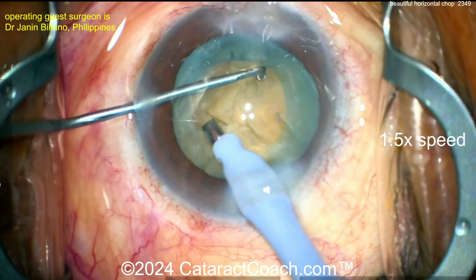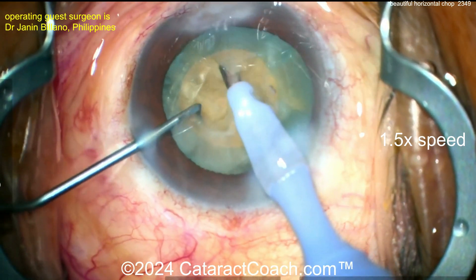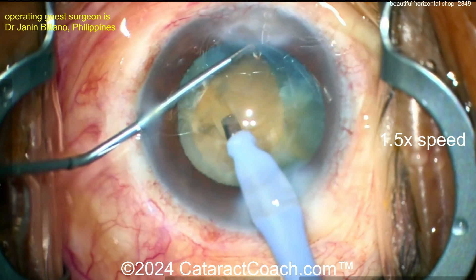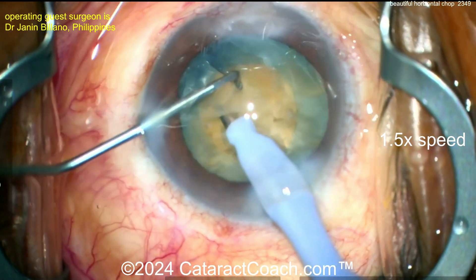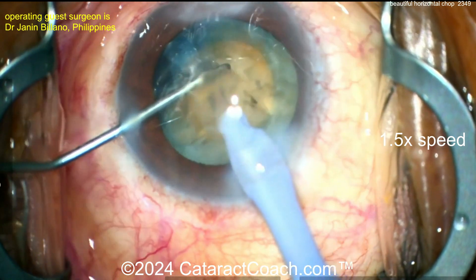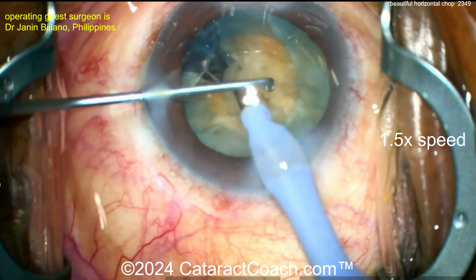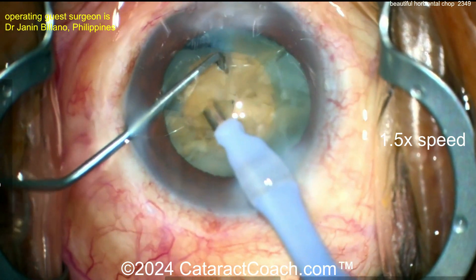Back to this case — it's all kind of attached at the bottom here, which is okay. You're going to get these pieces up, you just need to get one of them up out of the bag. Get that chop going, and as soon as you bring one out you'll have a lot more room. See — now with one piece out, there's a lot more room to maneuver. Now you can get the pieces split apart — see that? That makes it a lot easier.